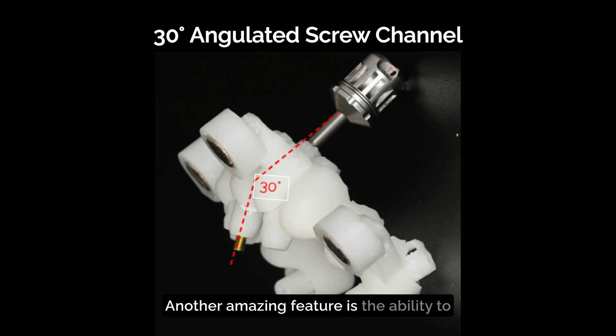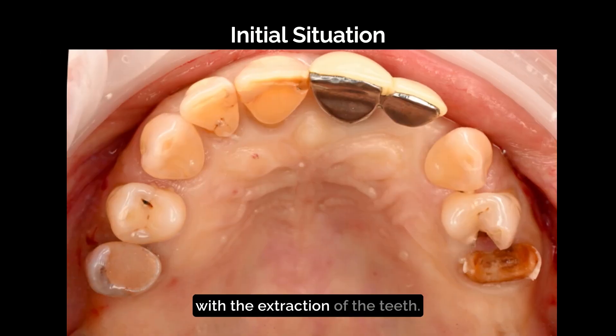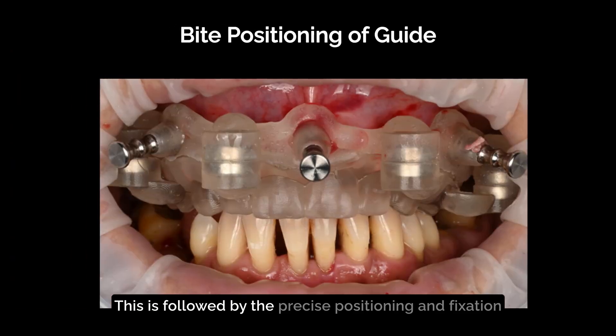Another amazing feature is the ability to angle the screw channel up to 30 degrees, allowing for highly aesthetic temporary restorations. Looking at the initial situation, let's start with the extraction of the teeth.